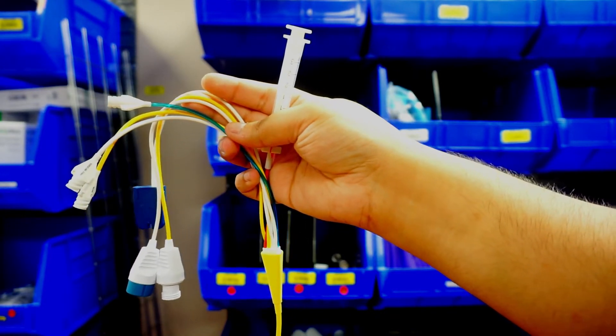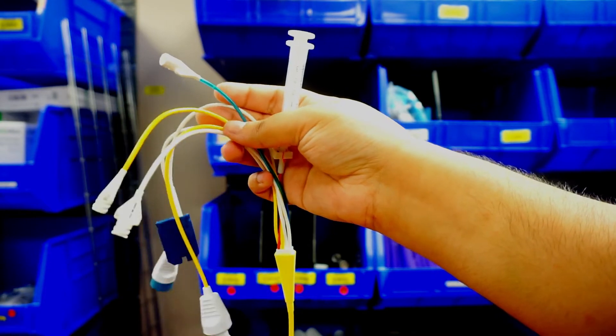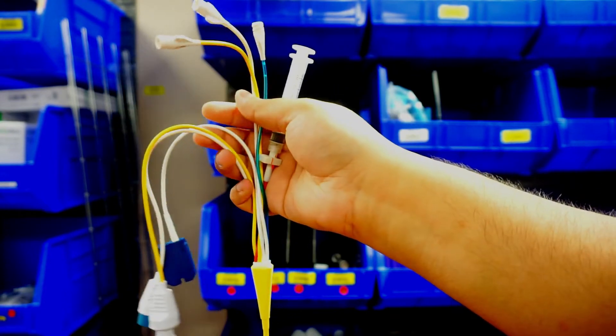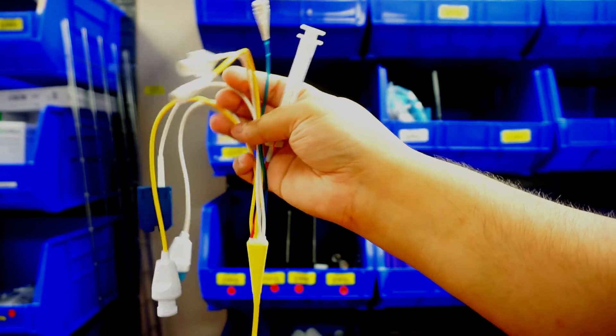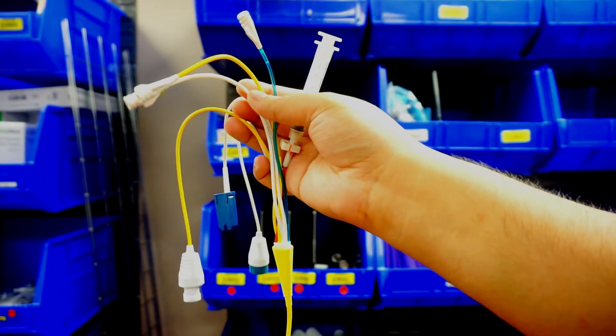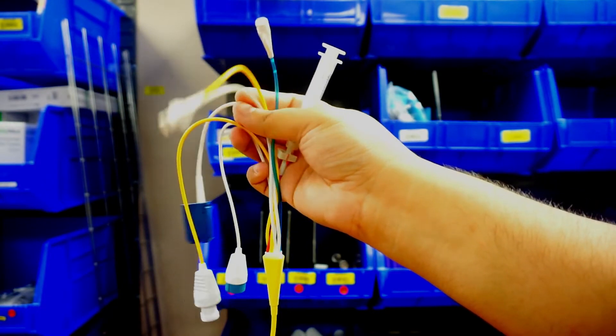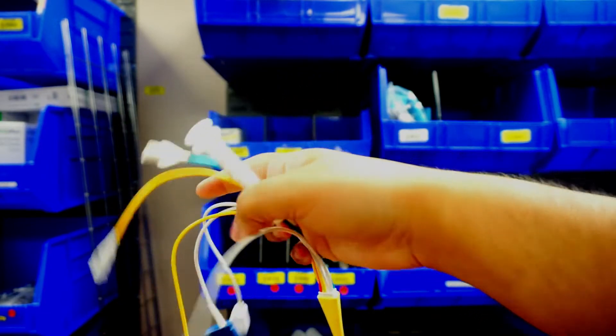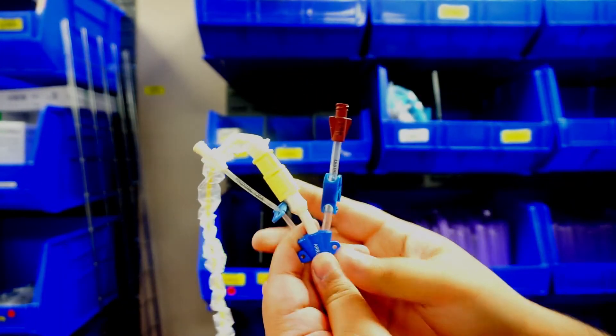I don't want to put it in a towel or in a bag and just leave it sitting around. We want this thing to be in the trash as soon as we take it out. So once you have this done, now you're going to come over to the end, the insertion point where the Swan is.